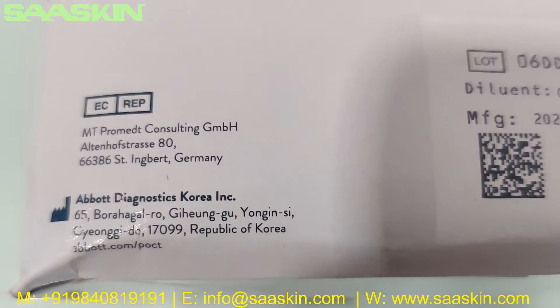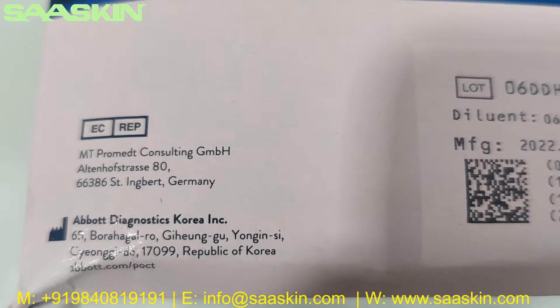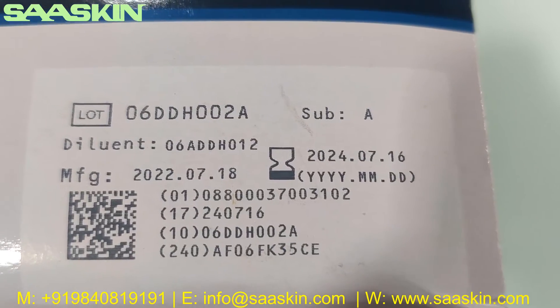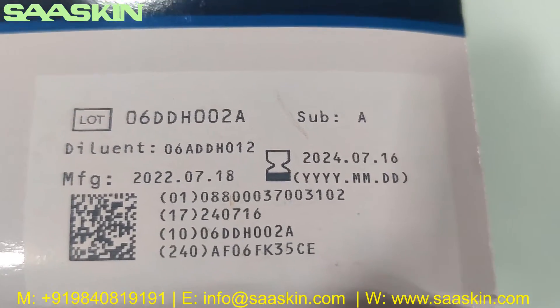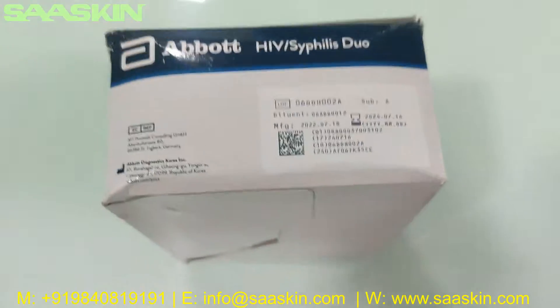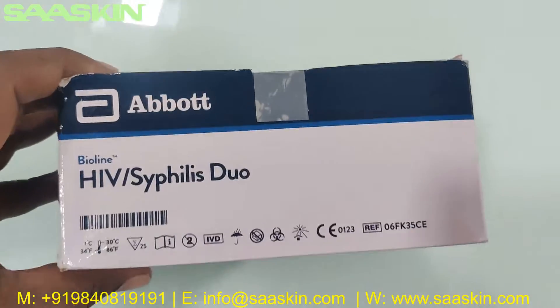The other side shows the manufacturing location from Korea — Abbott Bioline Korea. You can see the standard markings, and the kit has a 2-year expiry period. You also get the lot number on this front box.